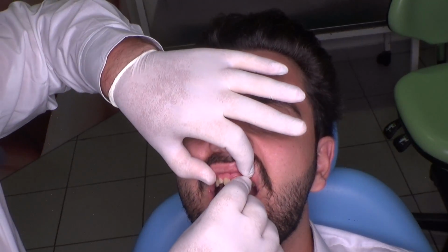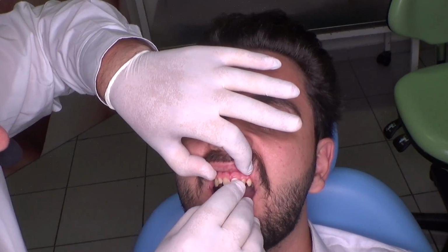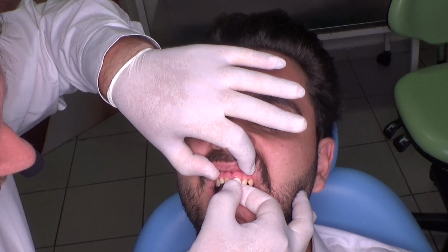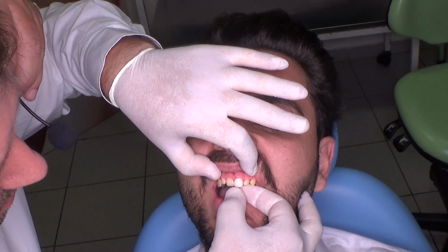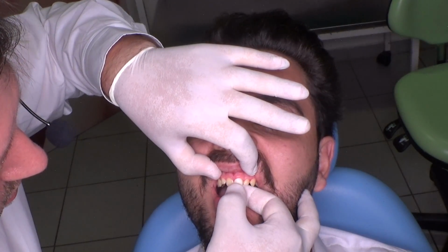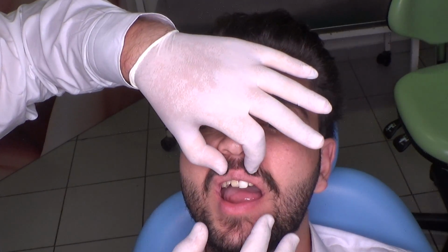And you put a piece of composite on the central incisor. It's simple as that. I want it to be slightly longer. You work with your fingers like this. You can make him rest position to see the new length.